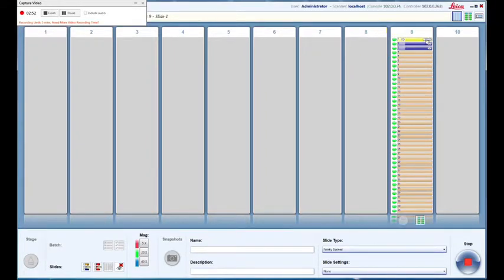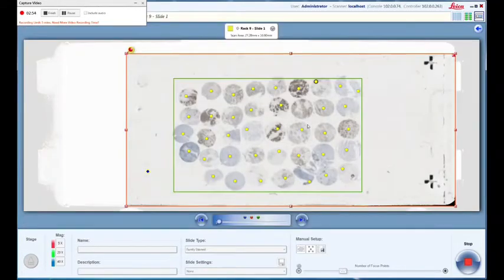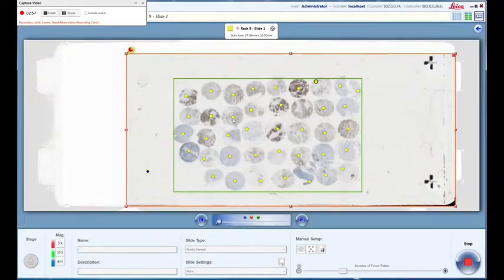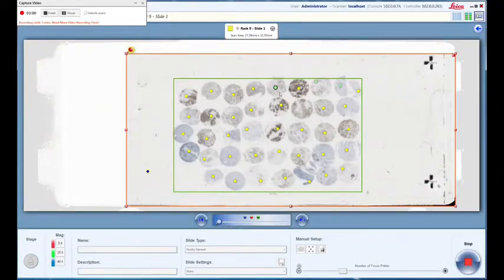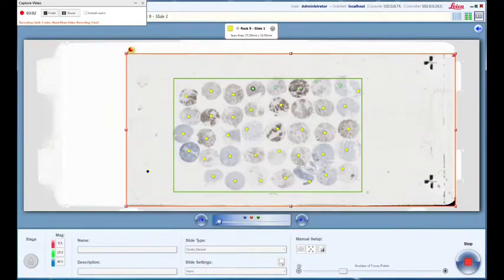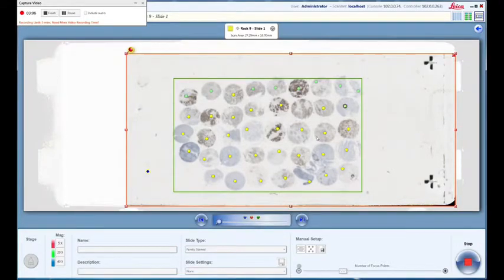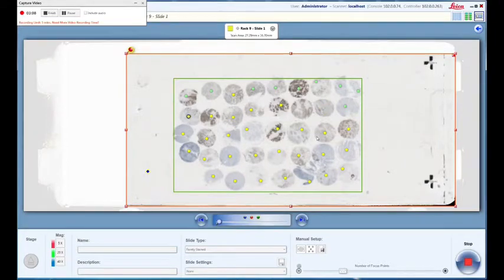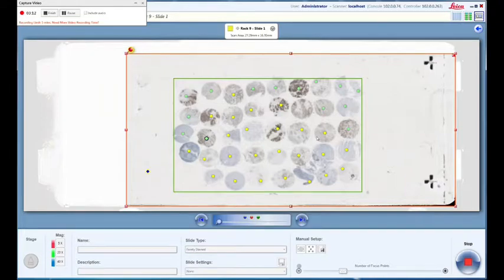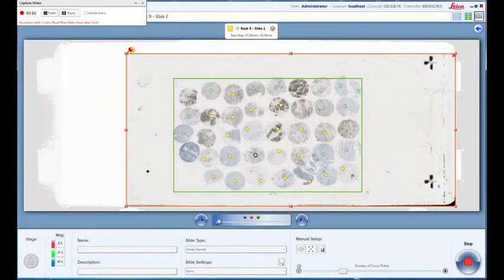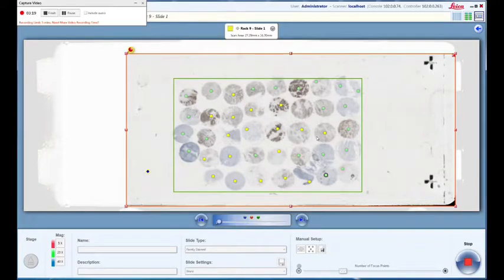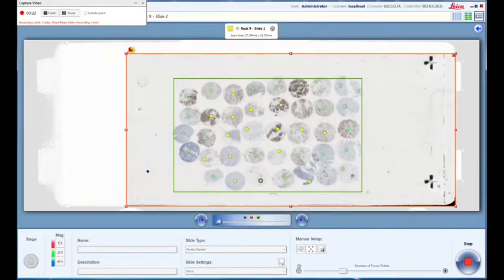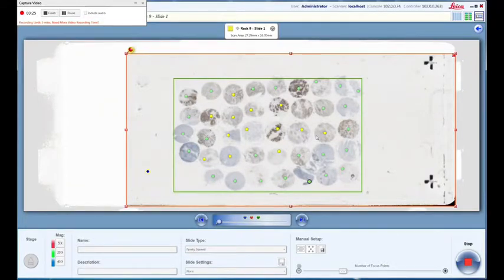Here we are scanning. You'll see that these focus points will start to turn green as the instrument calibrates to the slide and focuses on each one of those focus points. This process takes a little bit of time, but it's just easy to walk away from at this point.